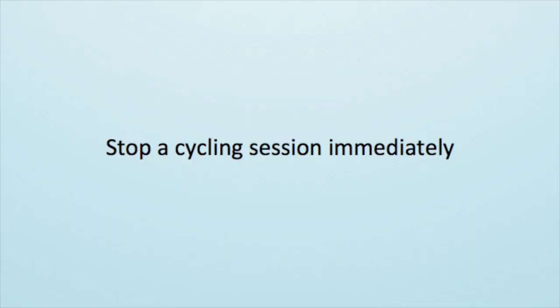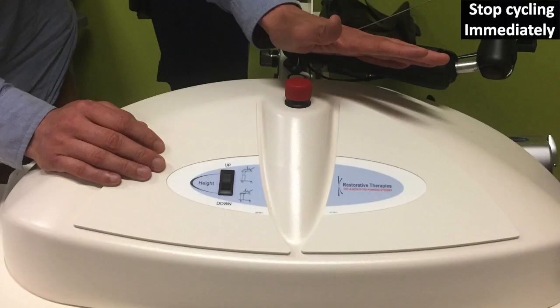If for any reason you need to stop the cycling session immediately, such as if there is an emergency or a safety event, press the emergency stop button.